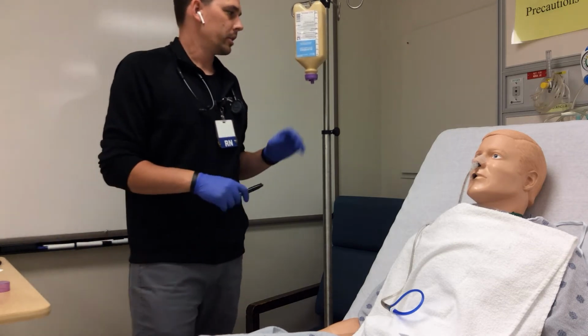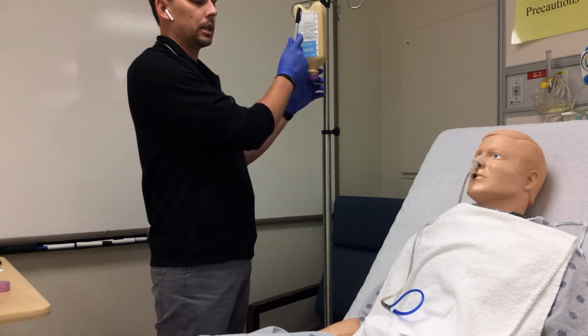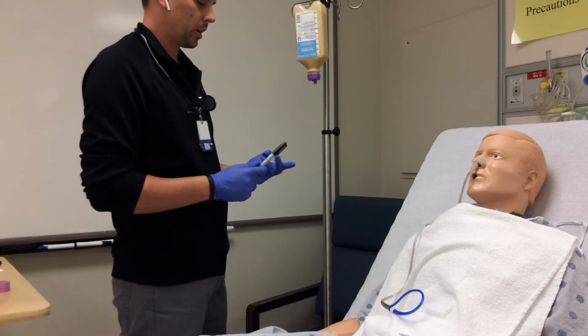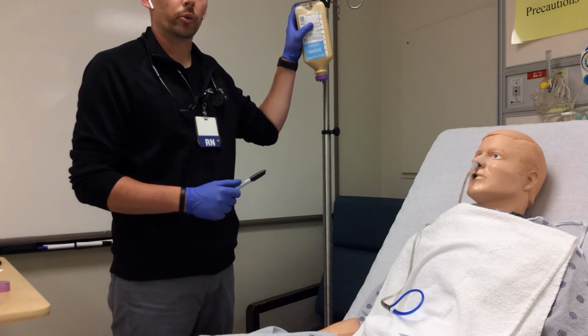Once we hang it, prior to spiking anything, we want to make sure we are labeling our tube feed. We want to make sure we're labeling the initials of the nurse starting it. We want to label it with the date and time that we are starting it as well. And then it doesn't hurt to put the ordered rate.